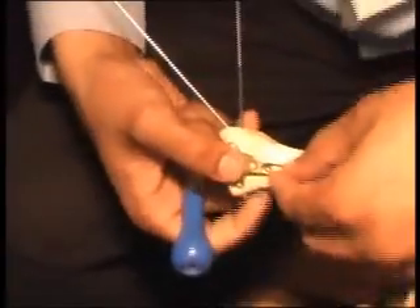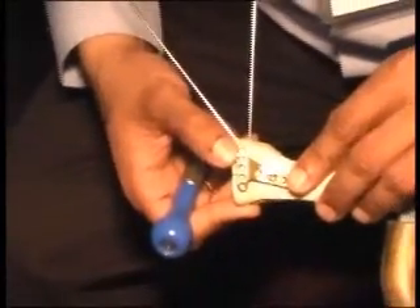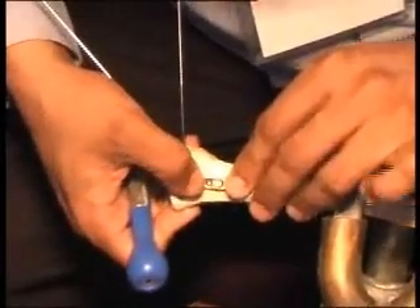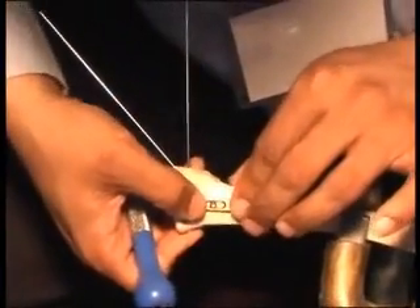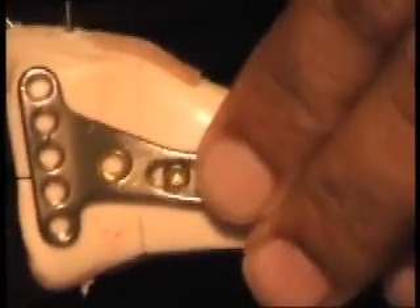Before tightening, you just slide your plate to where you want it — distally or proximally according to your fracture. You can also rotate the plate slightly to get more holes on a particular side; for example, if you want more screws on one side, just rotate it a little. Once you decide on the final position, that is your final placement.